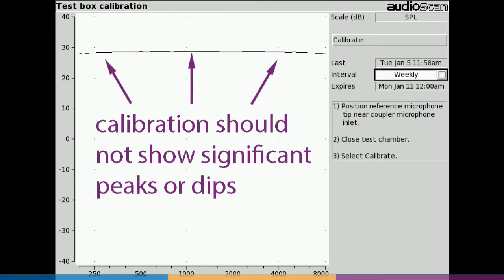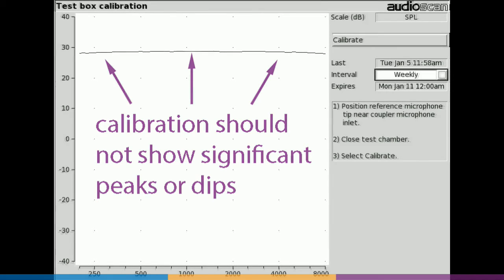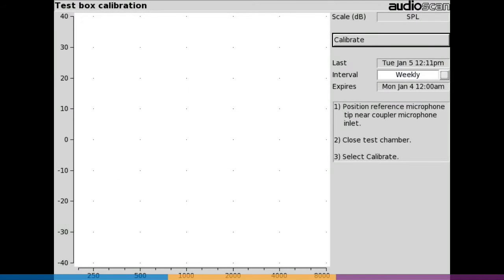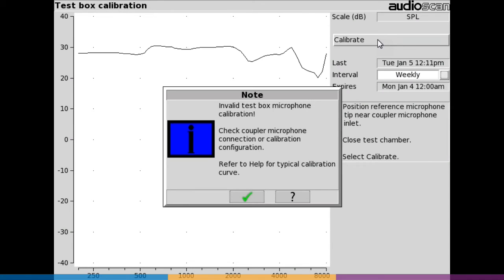The calibration curve should be fairly flat with no peaks or dips. Overall level is unimportant and may change with microphone model. AudioScan's smart calibration monitors for improper curves and will flag errors and warn the user.